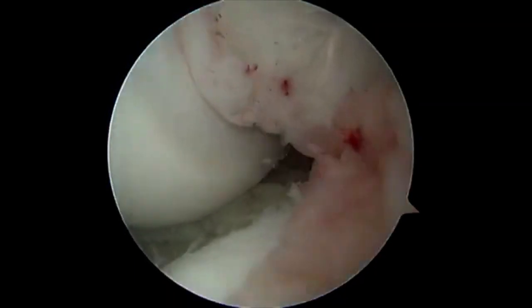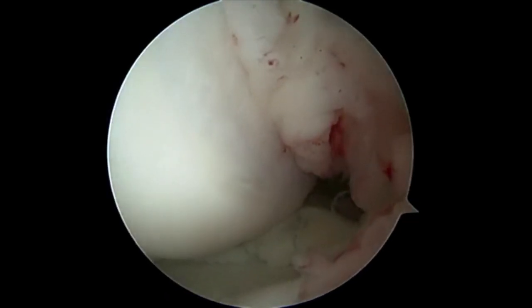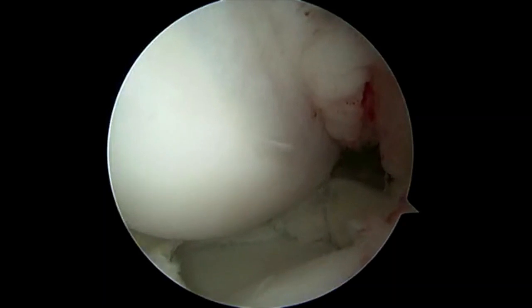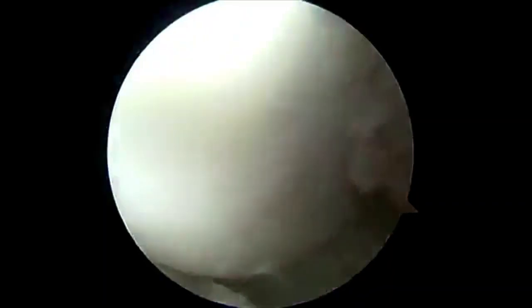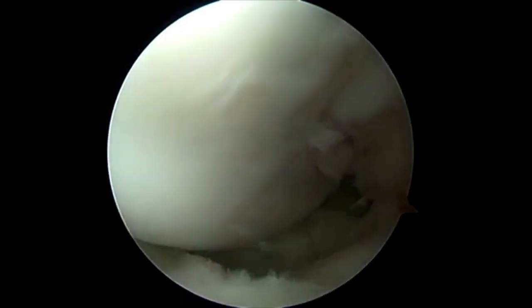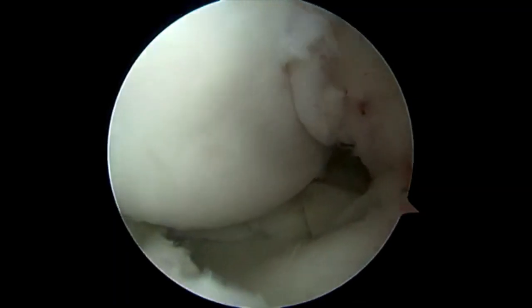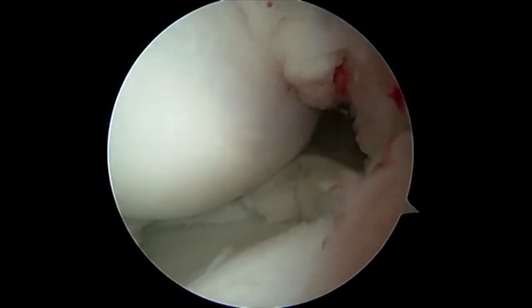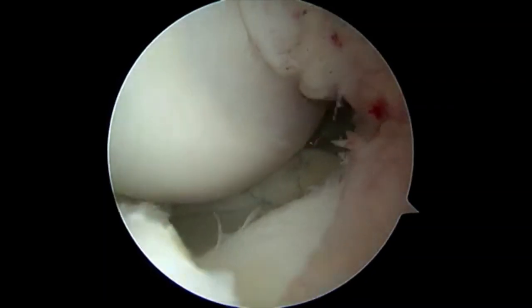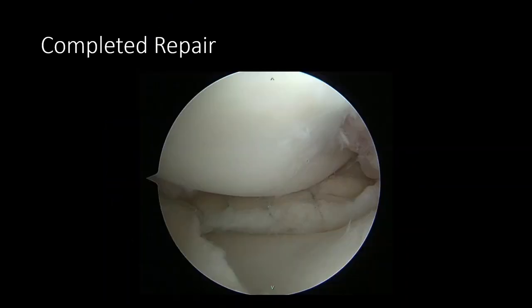A standard posterior medial approach for inside-out meniscal repair was performed using the previously marked incisions. Five inside-out vertical mattress sutures were placed over the posterior horn and body of the meniscus. The repair was begun posteriorly to secure the meniscus to the posterior capsule and carried on through the meniscal body. The suture needles were retrieved under direct visualization through the medial incision. After passing all the sutures, slight tension was applied and arthroscopic examination confirmed absence of subluxation. No subluxation was appreciated and the sutures were tied over the capsule.